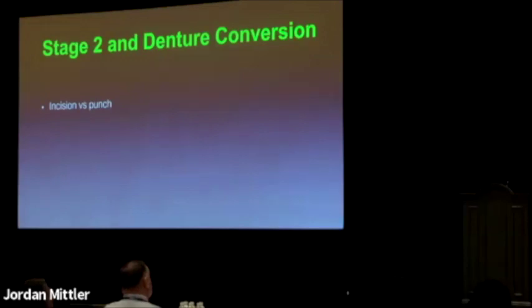You know, the advantage of the punch that day versus doing a very tiny incision, which sometimes can be done without even suturing. Usually I like to see where I am and be able to push more tissue off into the buccal to make sure we've got good keratinized tissue.